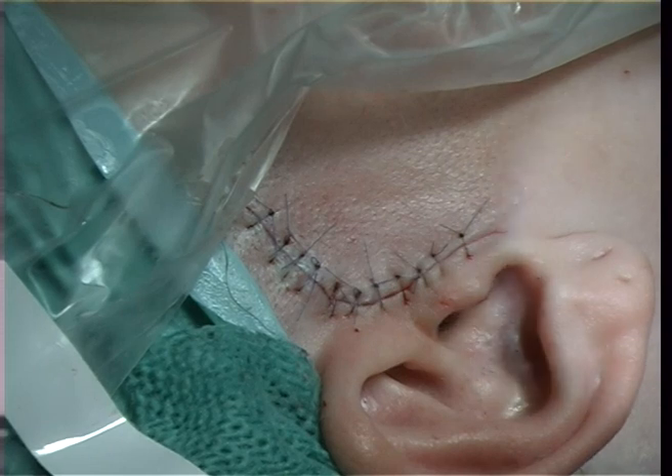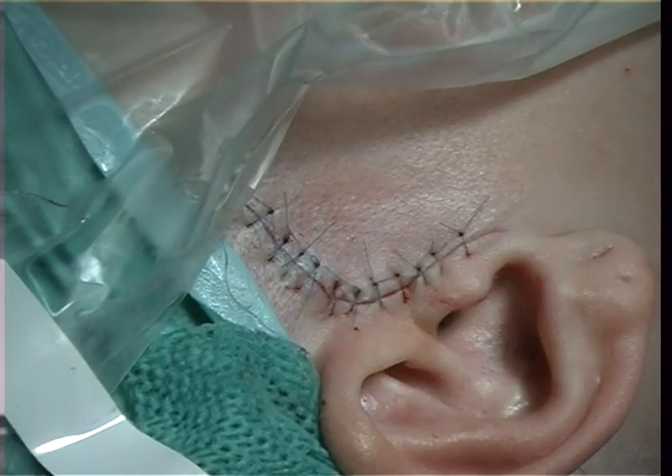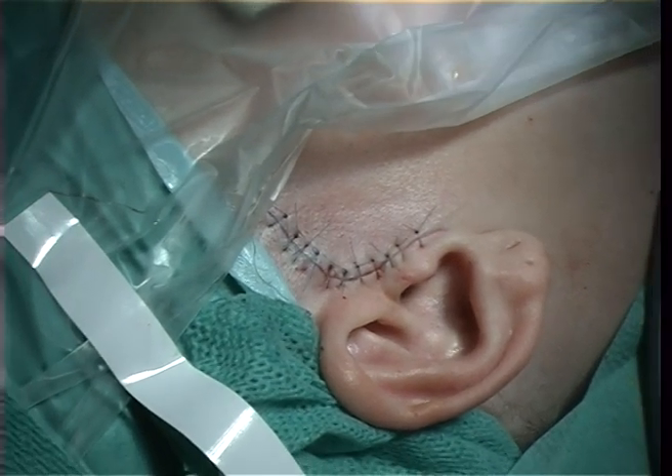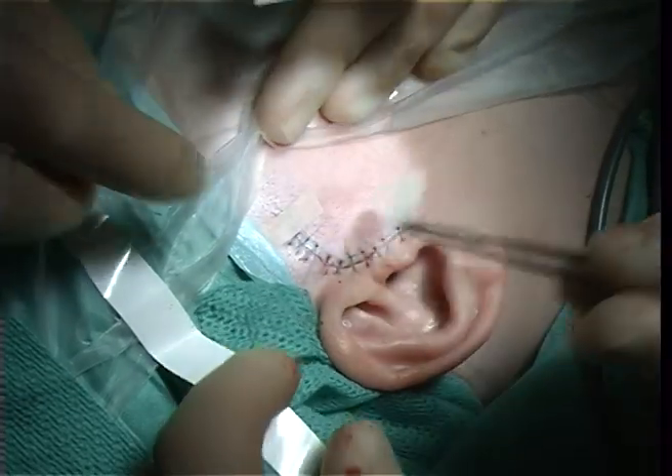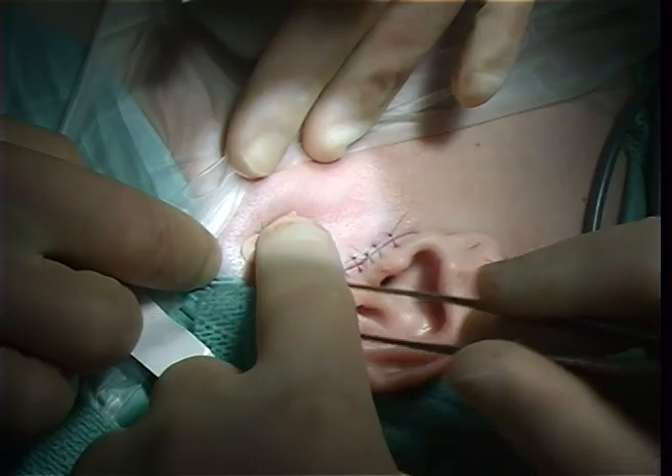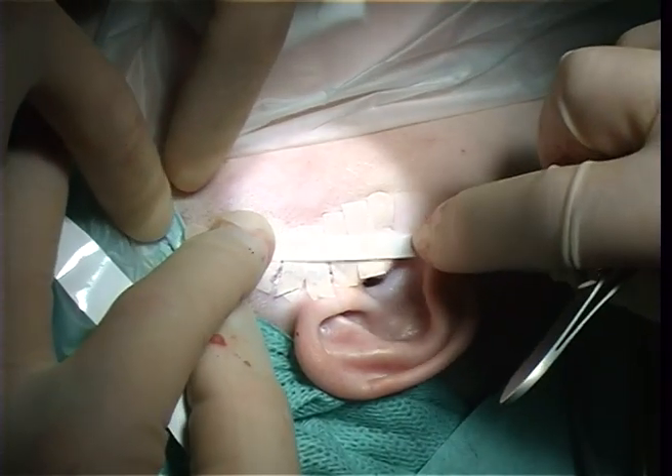It looks like that — we have finished the sutures. Then we put on a steristrip just to hold it in place, and that's all we use there. The surgery is finished.